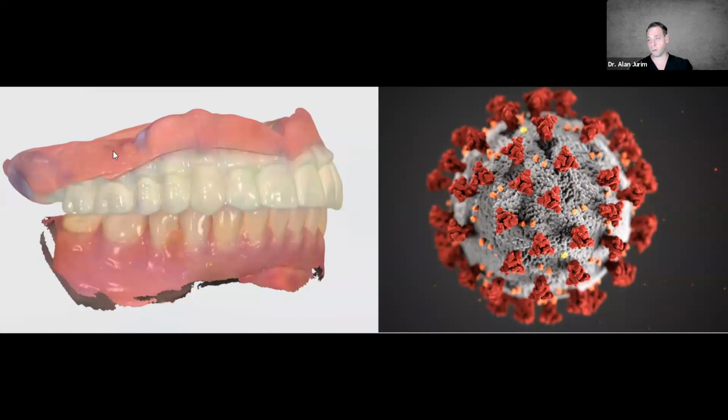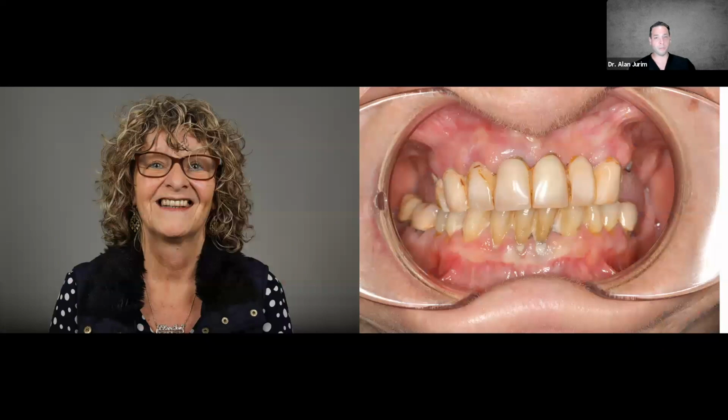Here's another really great workflow, and this is a little bit more advanced, but I love sharing this because it shows you how, once we think outside the box, 3D printing allows us to expand our workflows. This patient originally presented to us in need of some tooth replacement. What we had put together as our initial phase of treatment was to make an immediate maxillary denture and also a lower removable partial denture that she was going to wear throughout her first phase of recovery and healing.